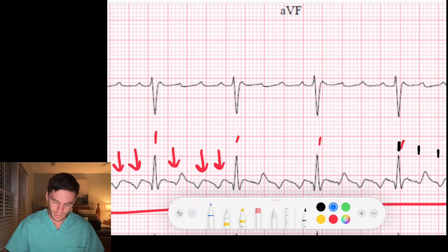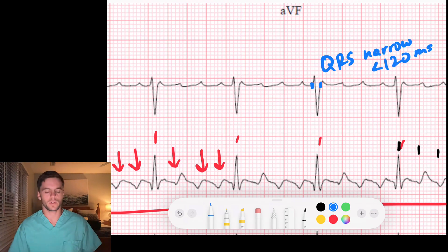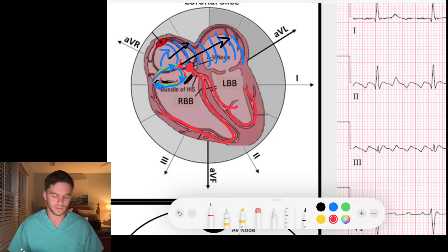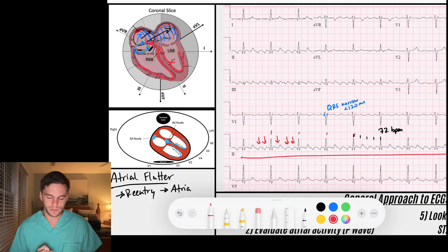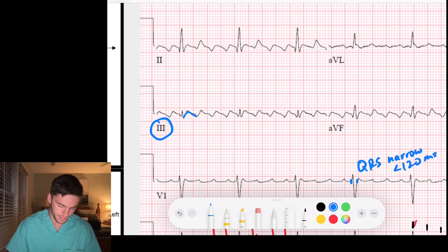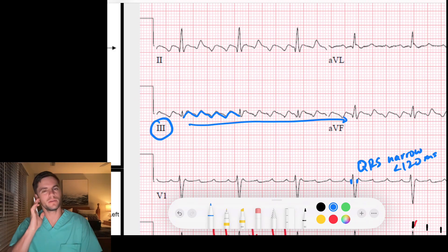My QRS complexes are narrow — less than 120 milliseconds — which tells me they are being generated by the AV node passing signal down through the His-Purkinje fibers, which are rapidly conducting fibers causing a narrow QRS. I'm trying to figure out what the baseline atrial activity is. Looking at lead three, I see a baseline pattern happening over and over again — a regularly occurring pattern — suggesting this might be atrial flutter.